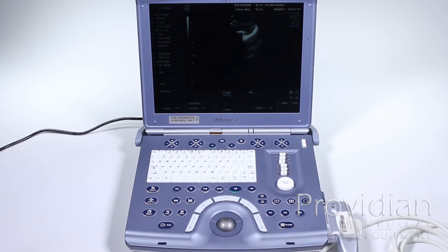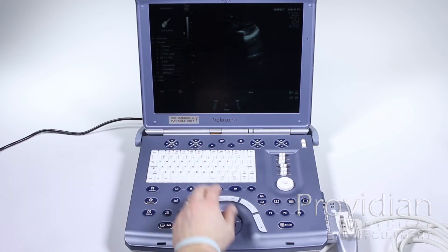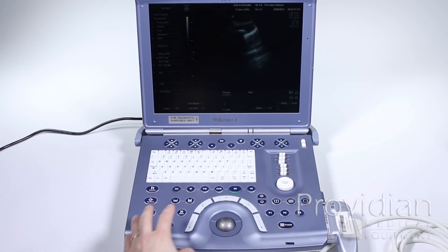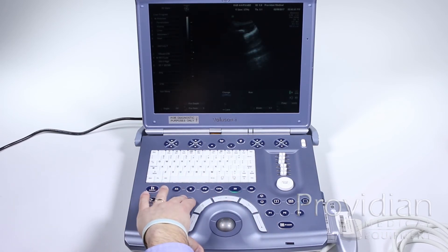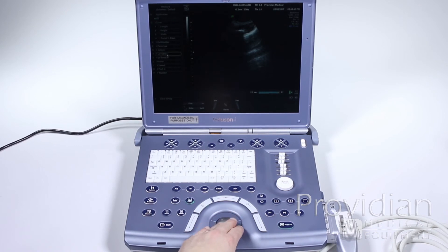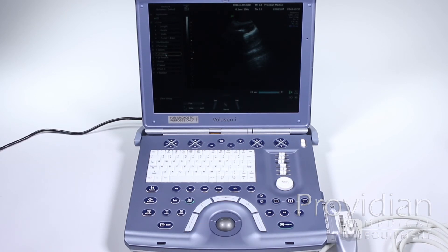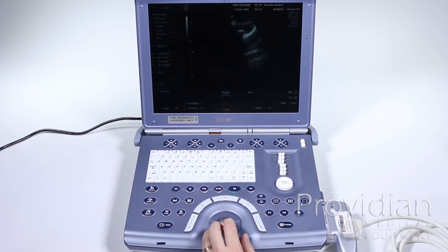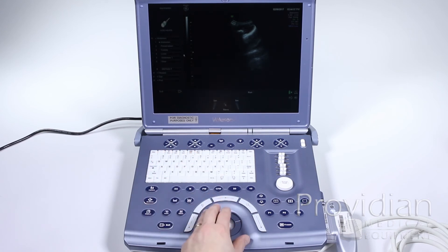If I was doing an abdominal study and had chosen an abdominal application to begin with — let's say I chose abdomen — when I click calc it's going to give me abdominal calculations. In the system setup you can change which measurements show up on that screen and what the default application is. So if you're using abdomen but still want OB measurements, or vice versa, you can assign those calculations to show up when you hit the calc button in that application. Let's go back to 2D and choose a different application.